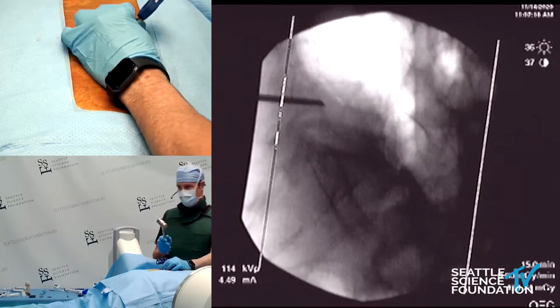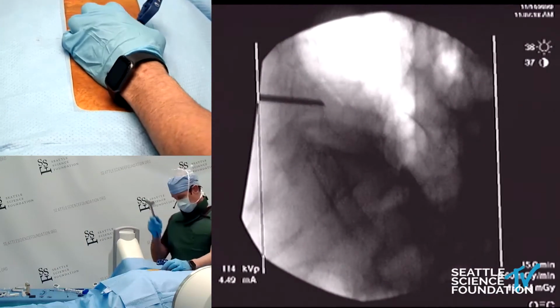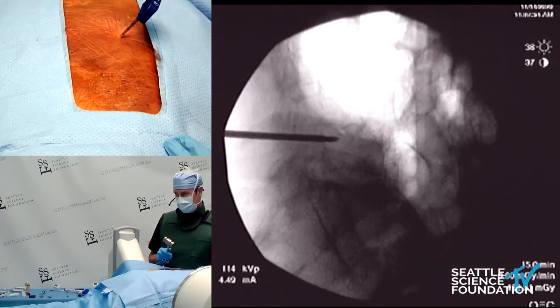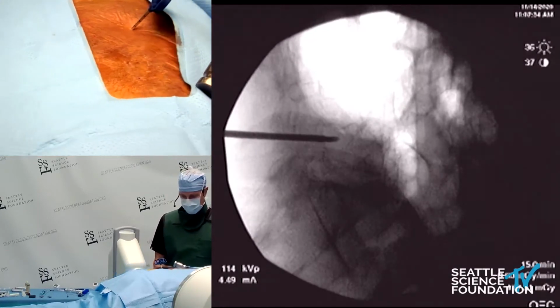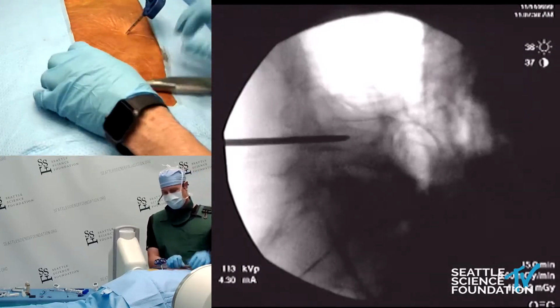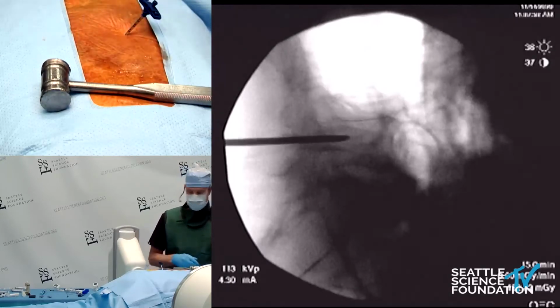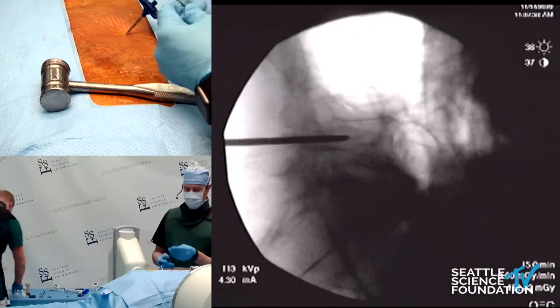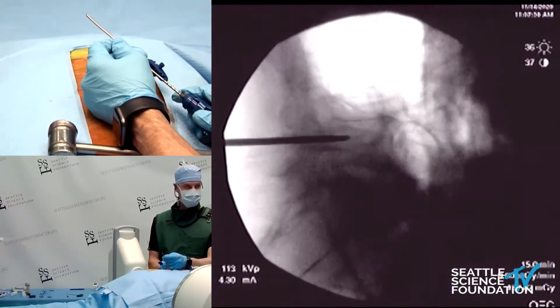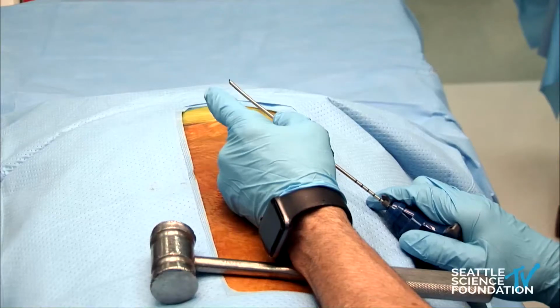So we're just inside, I'm going to turn the bevel around, advance it in, and we will switch from the access needle. Let's do a little poor man's wig wag, see if we can sharpen it up. Nice. Okay. So the stylet comes out. The power curve goes in. And this is beveled, so it steers opposite the bevel.